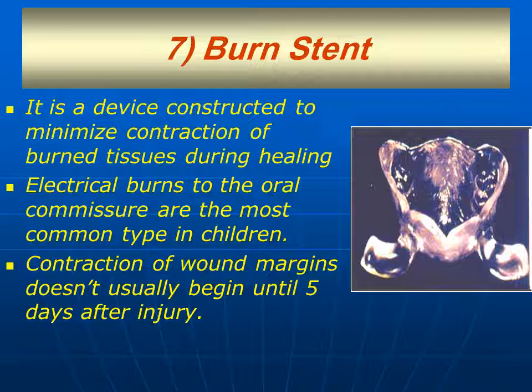In these situations, contraction of the wound margins after electrical burns does not usually begin until about 5 days after injury. So, if you construct a burn stent, it will preserve the opening of the oral cavity and prevent the formation of microstomia.